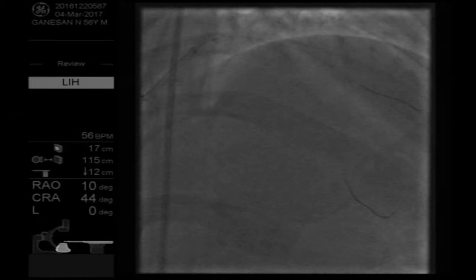Yeah, it seems as if the awareness that lesion preparation is important for implantation of scaffolds is raising our attention again to lesion preparation even when we're using metallic stents. Perhaps even in the past, some of us would have been tempted to go for direct stenting here. The lesions were not that tight. But certainly after the OCT imaging and the identification of the resistant plaque proximally, there is more attention than in the past, perhaps, to adequate lesion preparation.